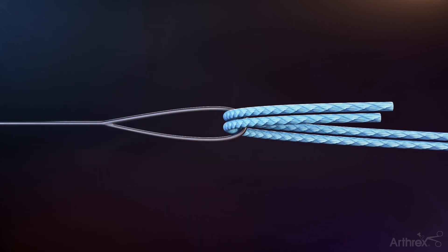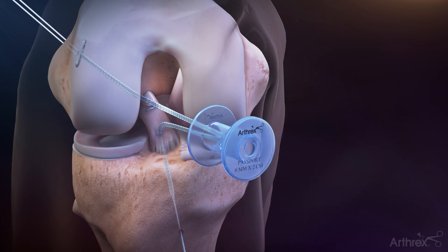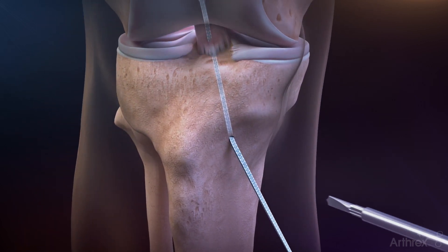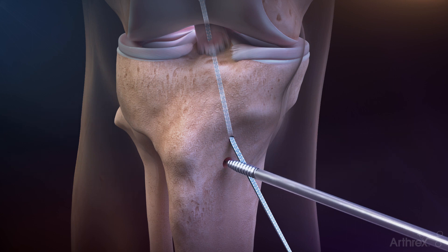Retrieve the lasso wire out of the passport cannula in the medial portal and load the blue fiber tape into the loop. Pull distally on the lasso wire to shuttle the blue fiber tape out of the tibial tunnel. Place the knee in full extension and use the spade tip swivel lock drill from the ACL backup fixation kit to drill a pilot hole one centimeter distal to the tibial bone tunnel. The drill is calibrated with a hard stop at 20 millimeters.